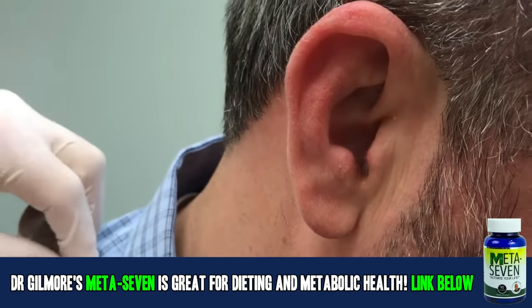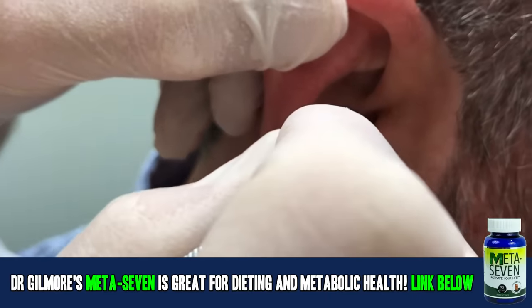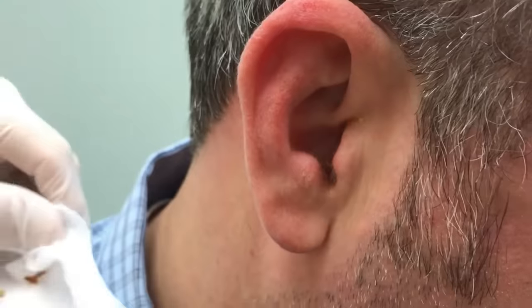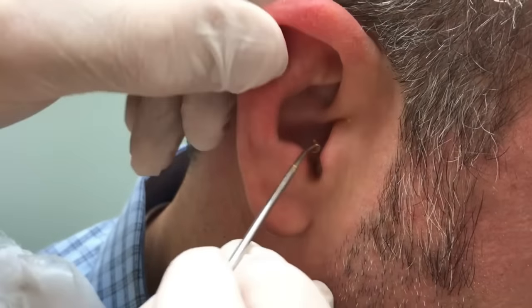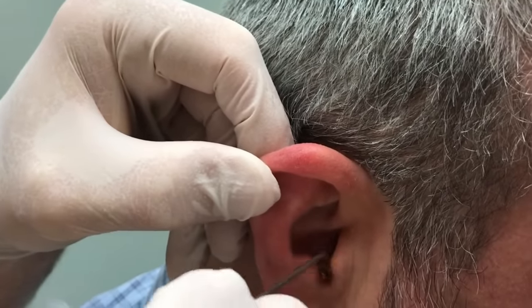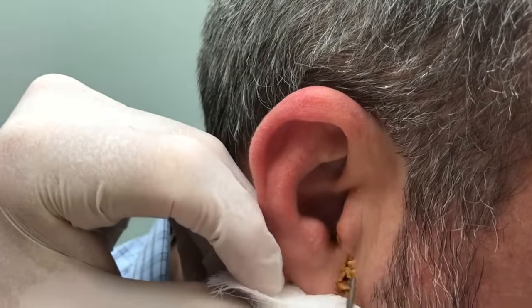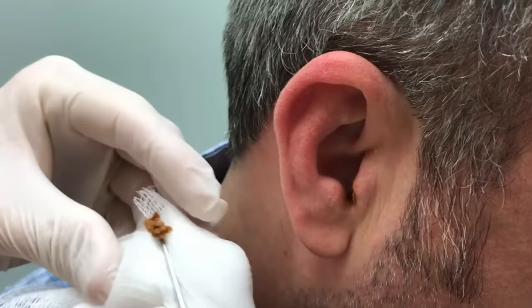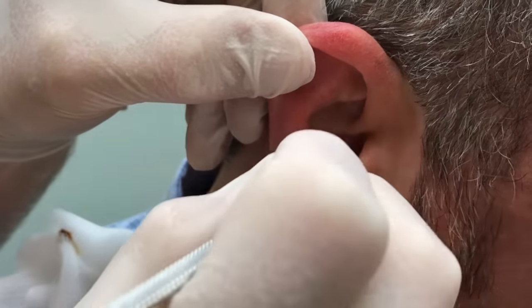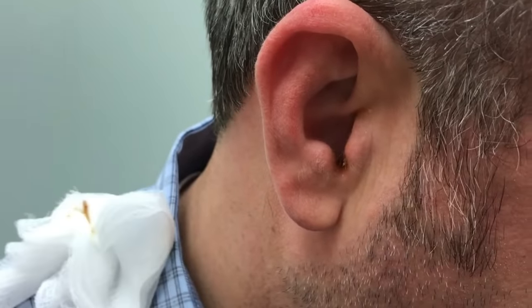A little chunk. The key to these is just take it slow, go easy. That was a good piece — a whole bunch right there. Look at that all coming out of there. Look at that one. I'm going to show this all to you in just a minute, Mr. Kansas. I think you're going to be impressed with the quantity as well as quality.